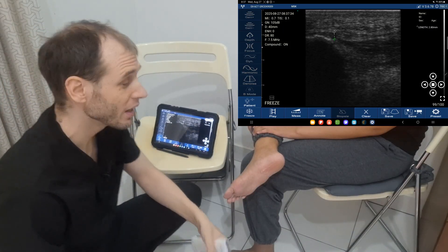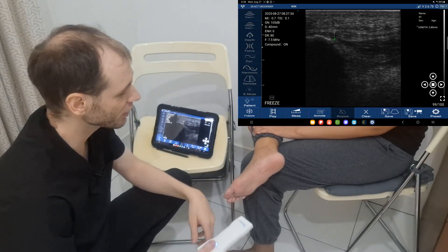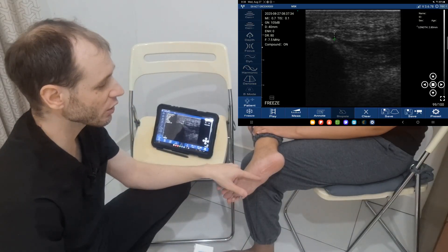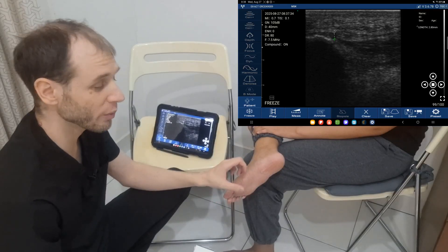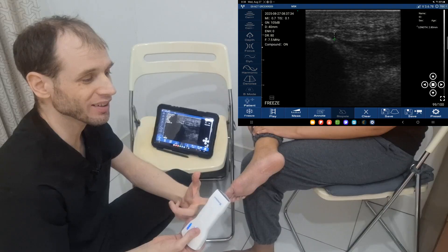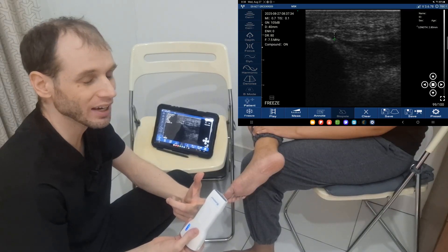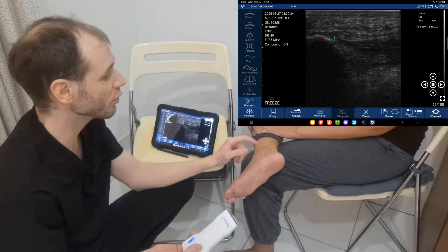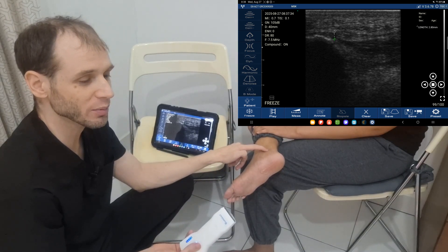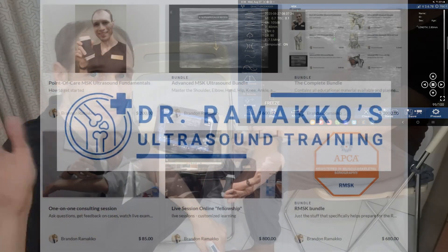Pretty easy. You can of course scan over the entire plantar fascia looking for other pathologies, and as mentioned you could look for myofascial trigger points either through palpation or with the ultrasound unit. Muscle that looks unusually hypoechoic — darker than usual — could indicate a myofascial trigger point. I also recommend checking the tibialis posterior tendon for tendinopathy. Anyways, I hope you found this useful. Cheers!